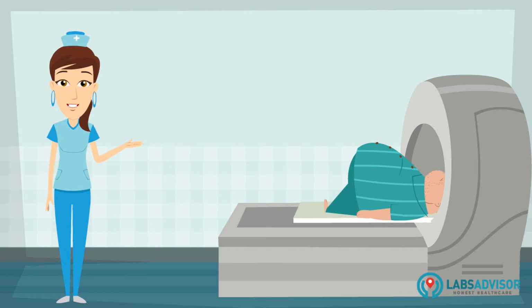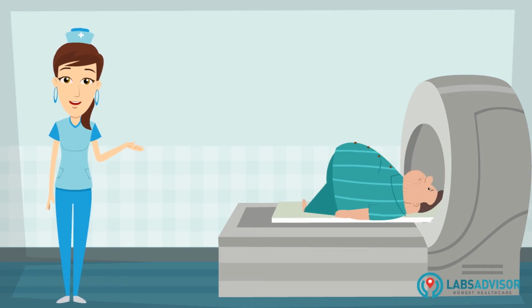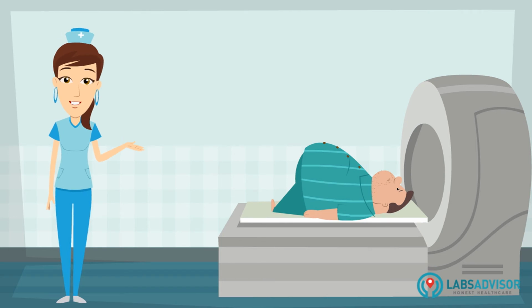The magnets in the MRI machine rotate around the body and create a strong electromagnetic field. These signals will then be picked up and sent to a computer to process the images. It is important to remain still during the procedure to get a clear image. It usually takes 90 minutes to complete the procedure.